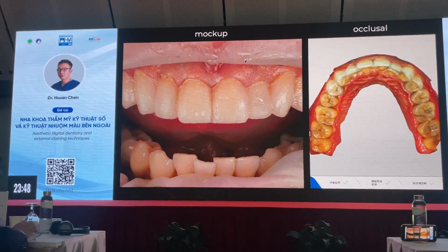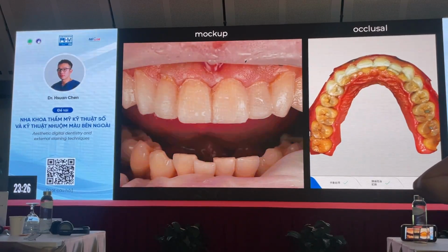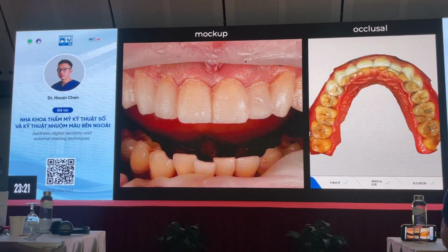This means that if I'm choosing the ceramic, and I need to choose between high translucency, medium translucency, and low translucency, what should I choose? I shouldn't choose high translucency, right? Because if it's a high translucency, it will be very much affected by the thickness. If it's very translucent and it's very thick, it will look very different from if it's very thin. If it's a low translucency, it might not look so different. So at this point, I already know that there are some ceramics that I cannot choose.